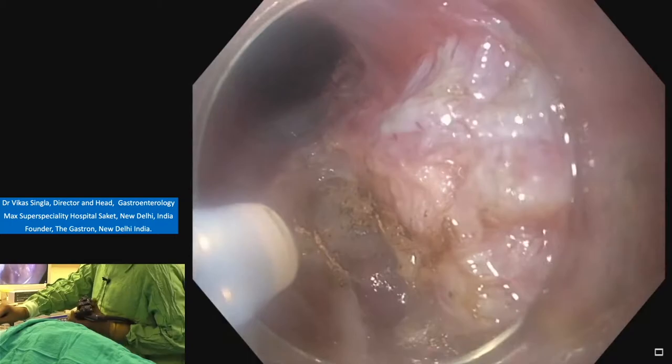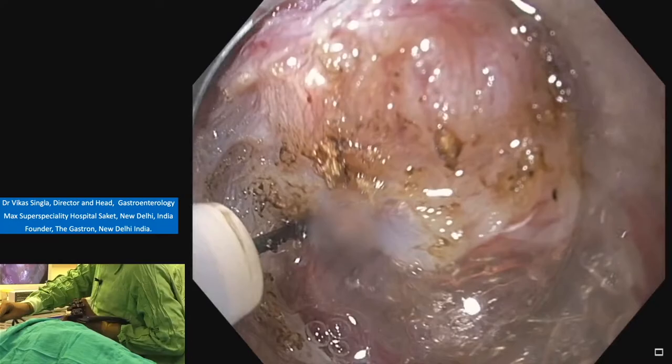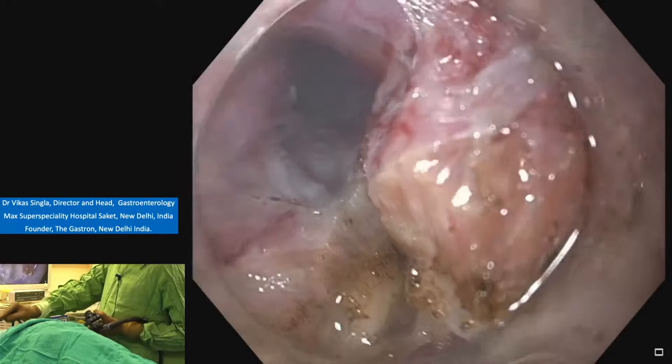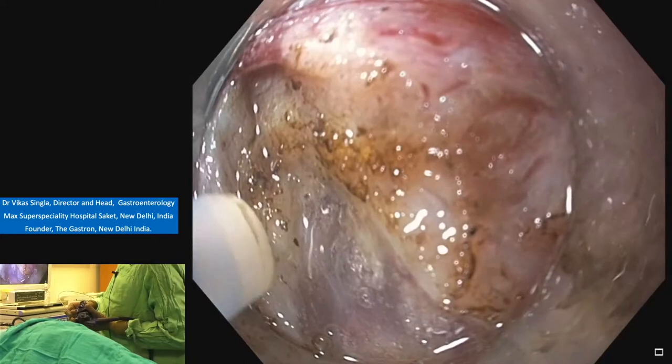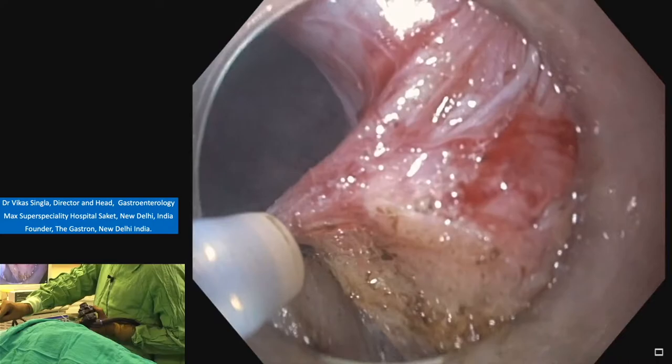One should always look for the vessel. You can see a vessel in adventitia. So just stay above the vessel there. Then lift, coagulate, and then cut. Again, we are deeper to the muscle layer, lifting it, and then cut.